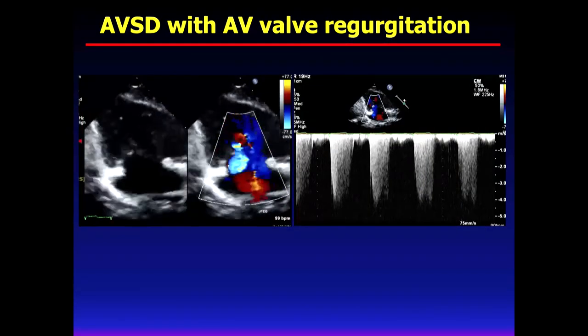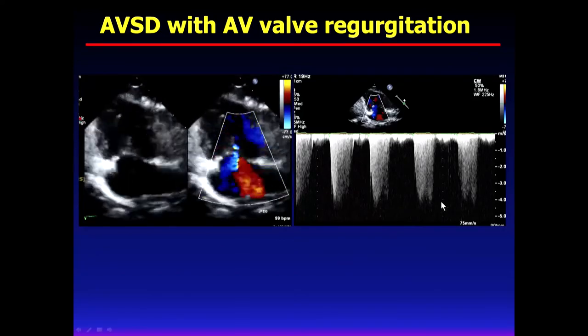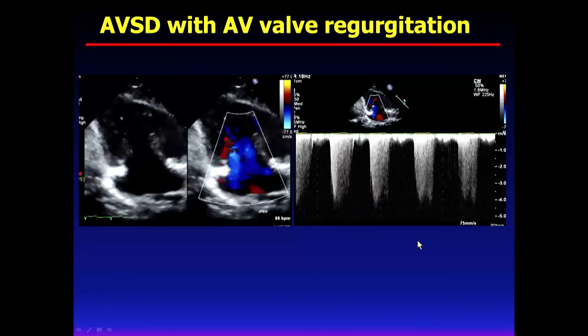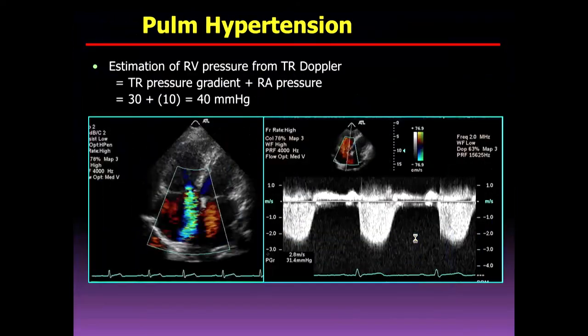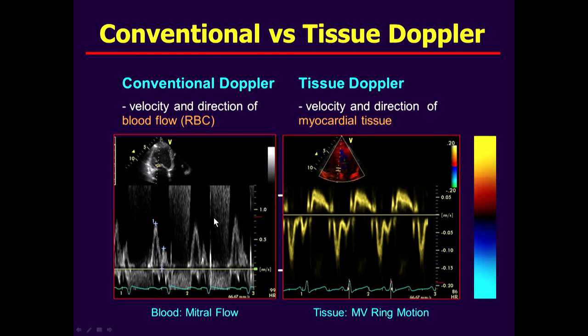And then this time, AVSD with AV valve regurgitation, we can notice the color Doppler and the continuous wave Doppler. We can estimate whether the ventricle function is good or not. And if some kind of disease is pulmonary hypertension, we can notice the severe TR and estimate the RV pressure and pulmonary pressure, how high. And conventional echo, I'm not talking about this time, but we have tissue Doppler echo and advanced methodology in echocardiography.